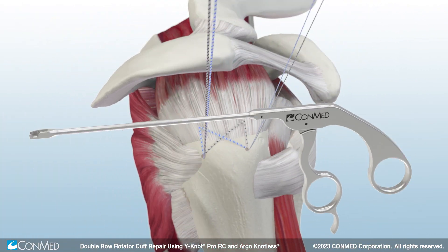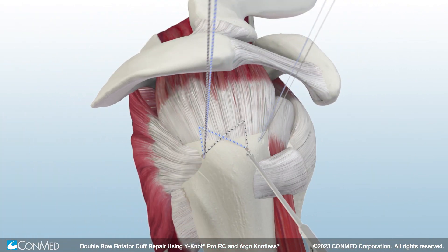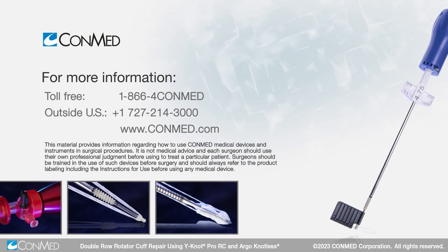Finally, use the Katana flush cutter to complete the cufflink double row repair.